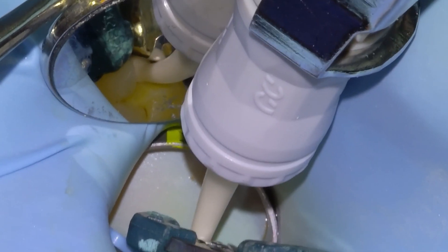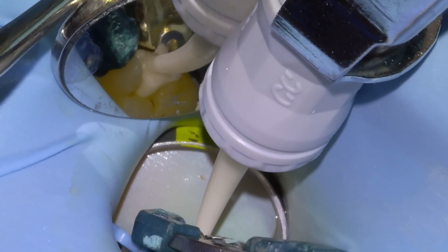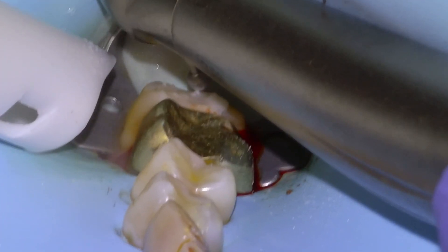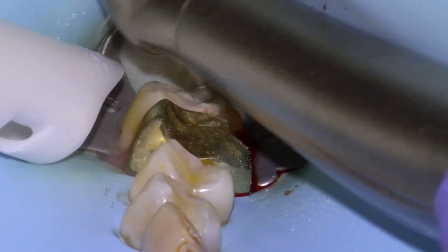There it is, matrixed. And then we will etch five seconds, rinse, dry, and then apply the restorative material, Acquia Forte, pack it with a moist cotton pellet, and then leave it for five minutes, come back, remove the separator and the matrix assembly, and then begin reducing the excess restorative material with a high speed.